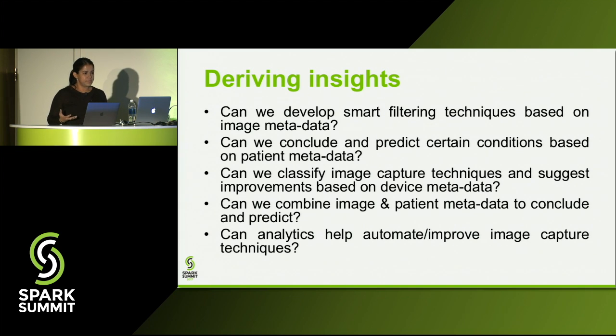Maybe if we can make some sort of analysis that people with high cholesterol in this age group, or this blood sugar level, look like they have this tumor or this condition, as reflected in their image data. That's fairly interesting because we're now able to combine two very different data sources, that's image and numerical values.